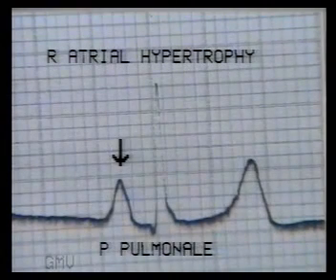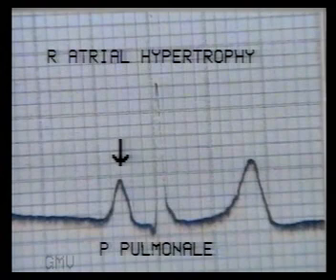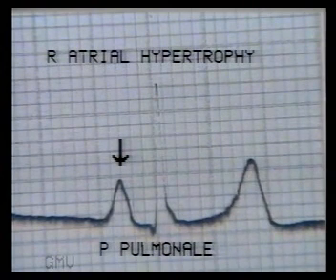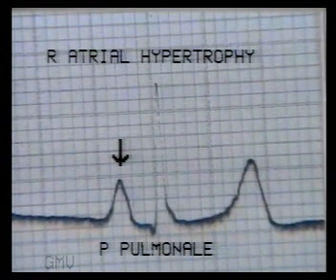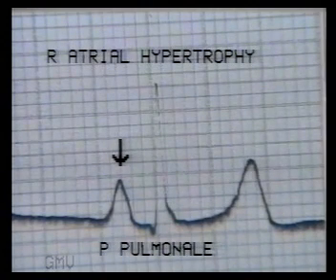In this ECG, lead 2 shows a tall and peaked P wave that is 3 small squares tall. This is P pulmonale, suggesting right atrial hypertrophy.